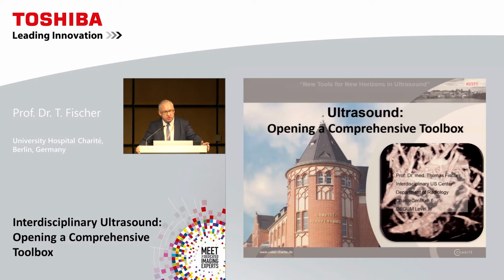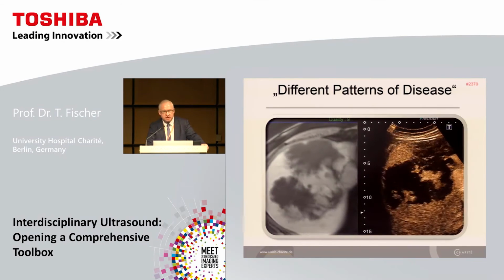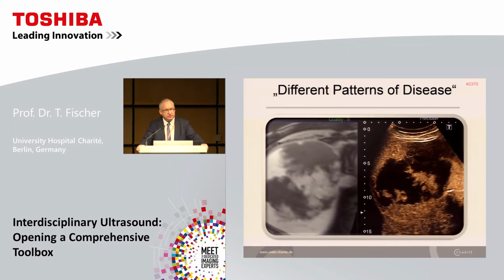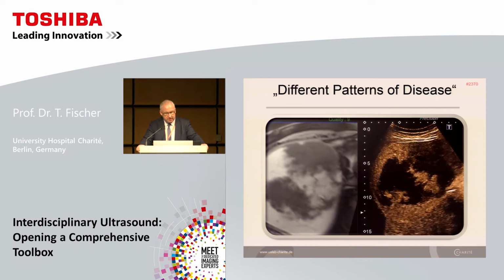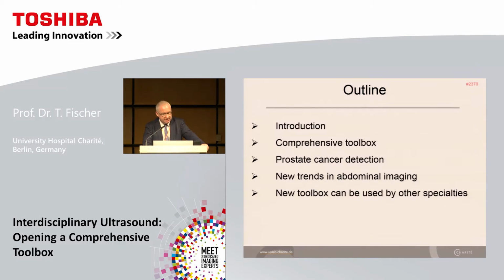And this talk is focused on ultrasound, of course. And we have to open a comprehensive toolbox. What does it mean? The focus of this talk is on different patterns of disease, showing this giant hemangioma with this typical enhancement pattern as an example. To understand how it works, I'd like to give you a short introduction and move on to this very special toolbox in different settings.